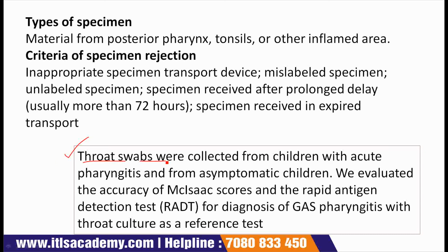Throat swabs were collected from children with acute pharyngitis and from asymptomatic children.